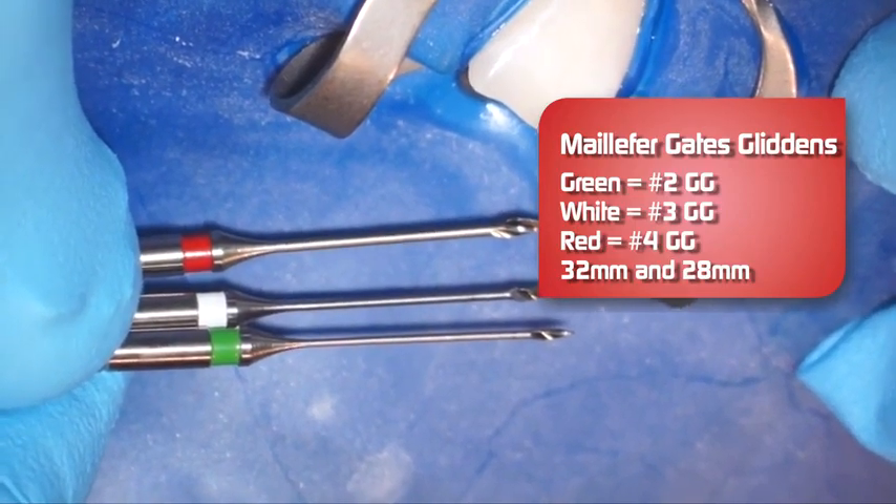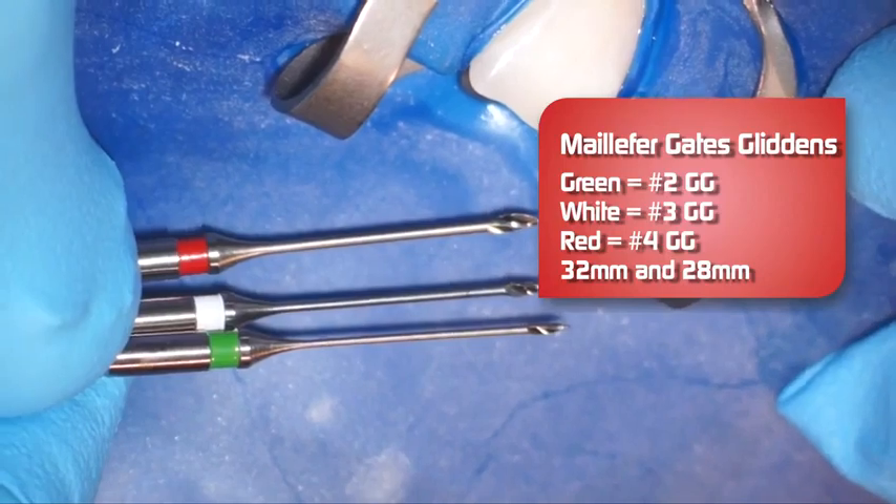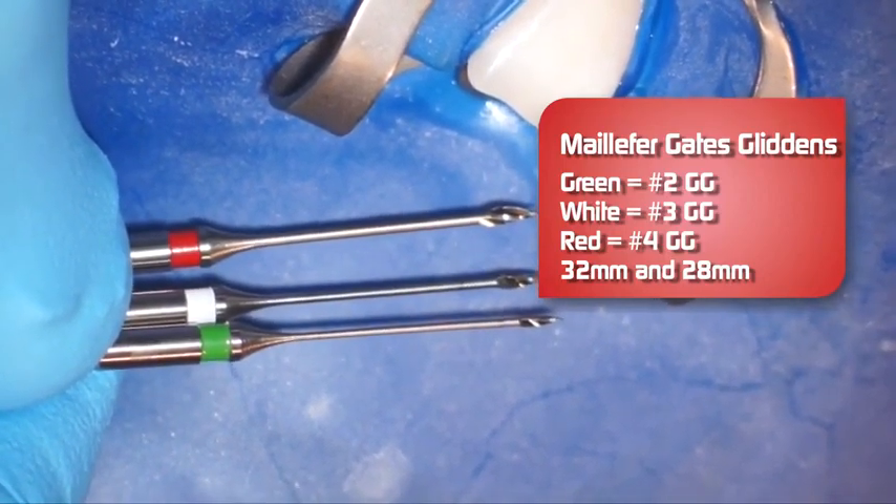We are going to use the 32 millimeter length Gates Glidden in this tooth because our measurement is 23 and a half millimeters, and I want to be able to use the full length of the Gates Glidden. They also come in 28 millimeter length for shorter teeth, but for this tooth the 32 millimeter is appropriate.